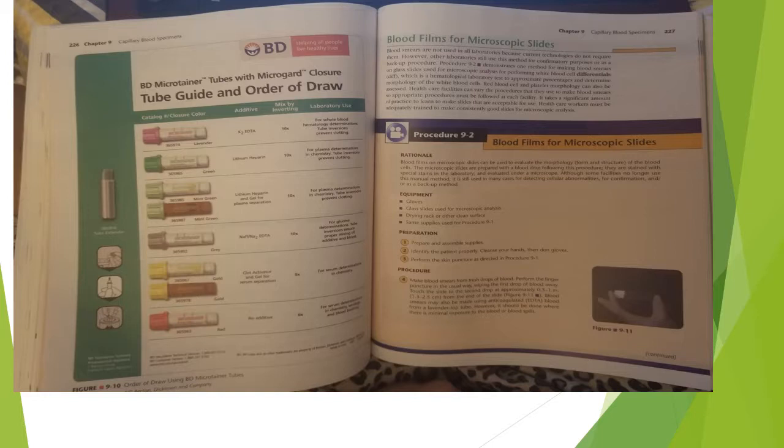Healthcare facilities can vary the procedures that they use to make blood smears, so appropriate procedures must be followed at each facility. It takes a significant amount of practice to learn to make slides that are acceptable for use. Healthcare workers must be adequately trained to make consistently good slides for microscopic analysis.